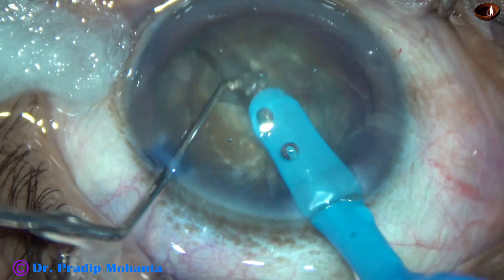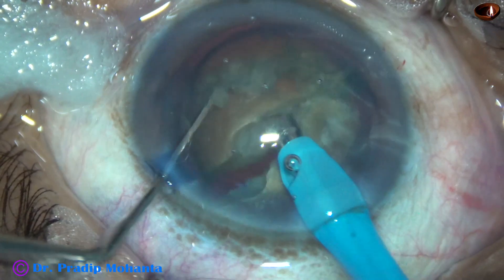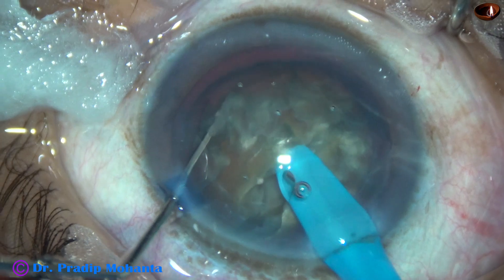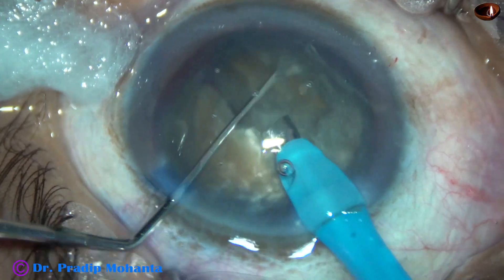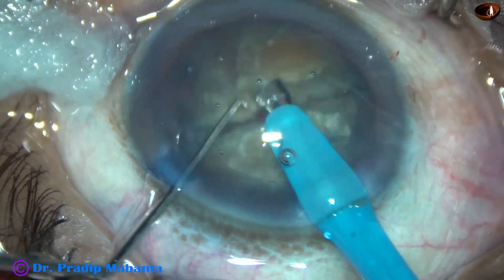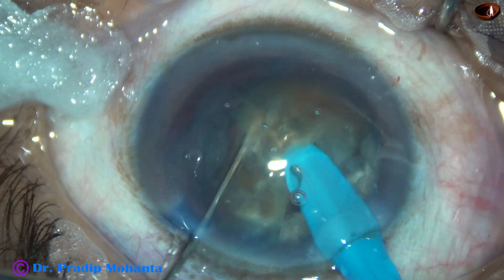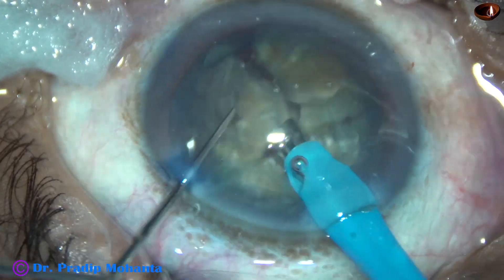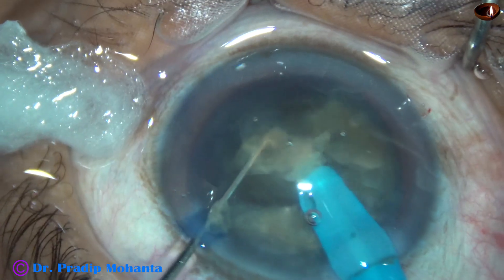So, rotate it 180 degrees, come to the other side. Along that initial crack, divide the nucleus into two hemi-nuclei. This is complete separation. Now dividing one hemi-nucleus, then the other. The tip goes through the substance of the lens matter and at one shot you can divide the nucleus.